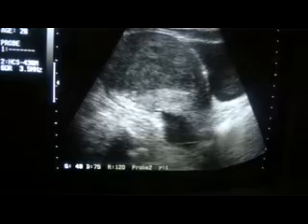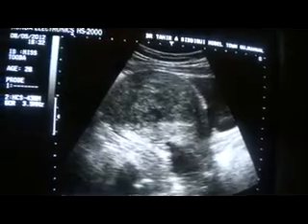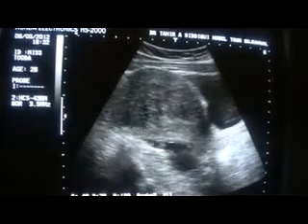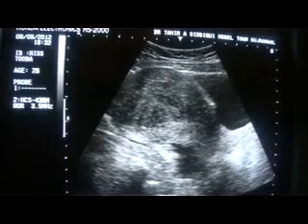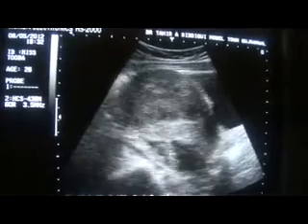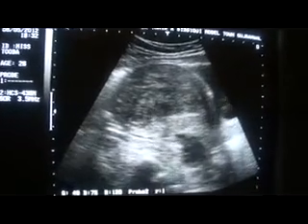The uterus measures 10.6 centimeters in length, which is normal, 6.1 centimeters in anterior-posterior diameter, which is much more than acceptable normal, because the normal is 5.0 centimeters. The patient has the anterior-posterior diameter of 6.1 centimeters. Longitudinal section. Now the transverse section.